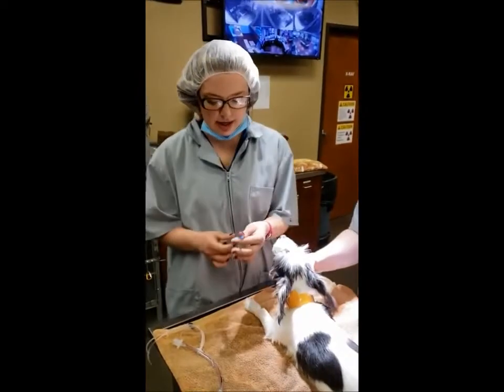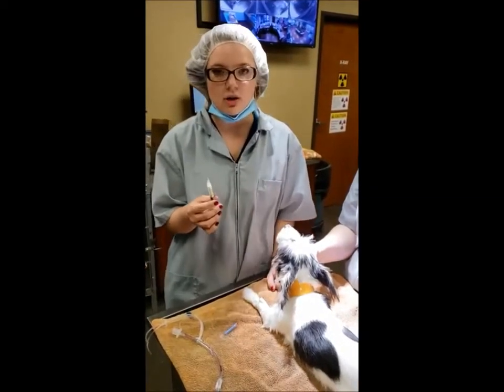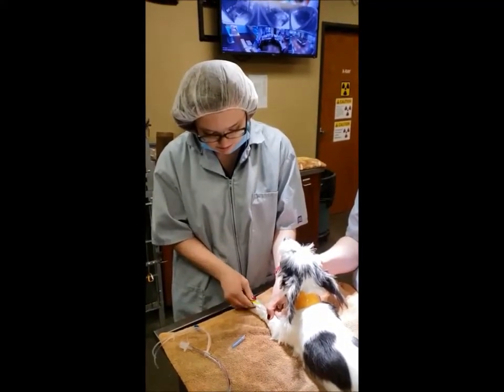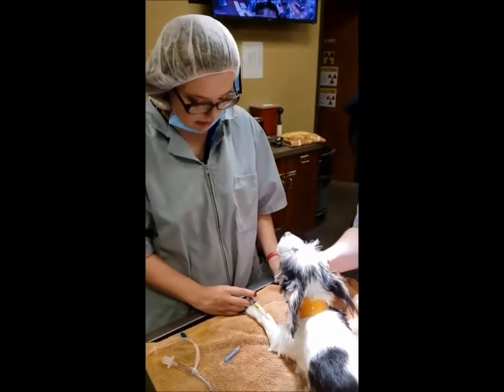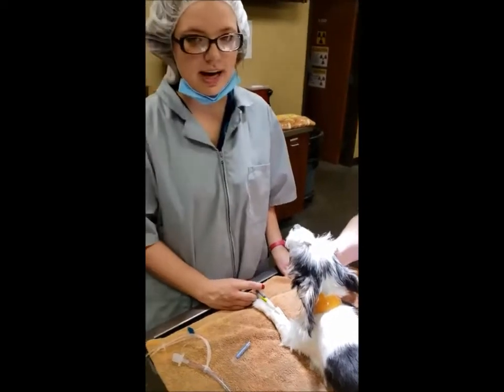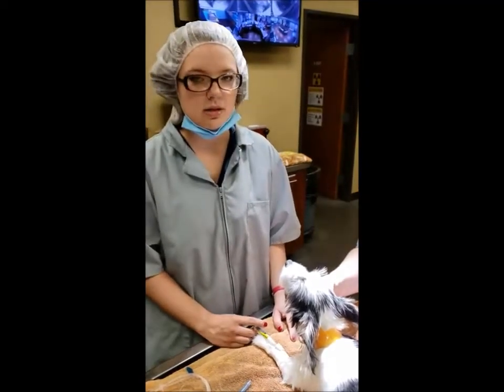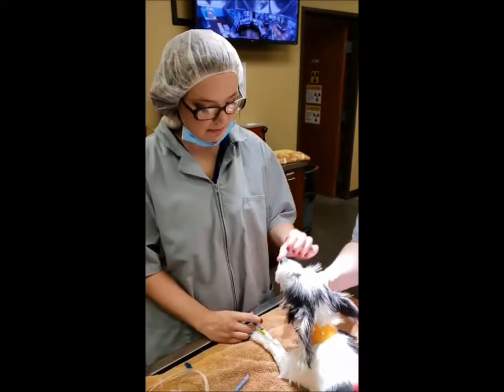Okay. I'll go ahead and induce our patient with our anesthetic agent. It is called propofol, and I'm going to give this IV. And you want to give this slowly, not too fast, because you can drop their blood pressure. And you give this to effect. So I'll give this until he's ready to intubate.